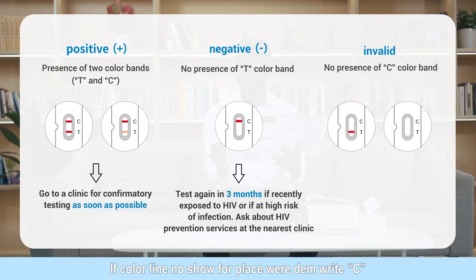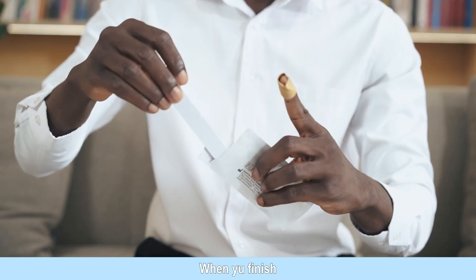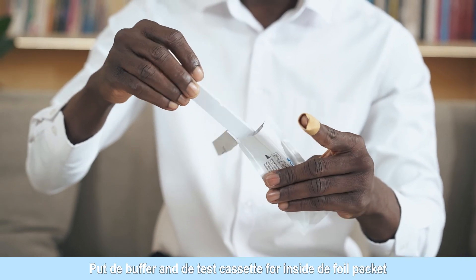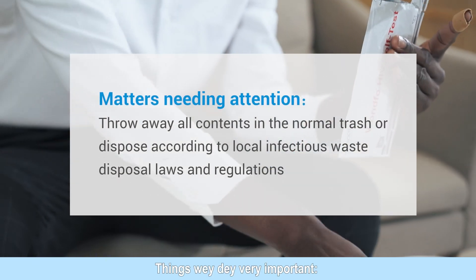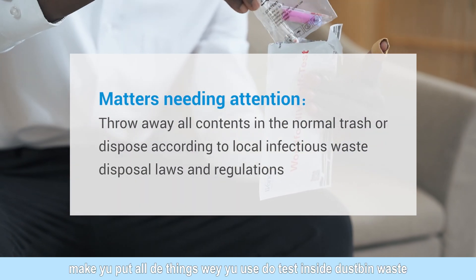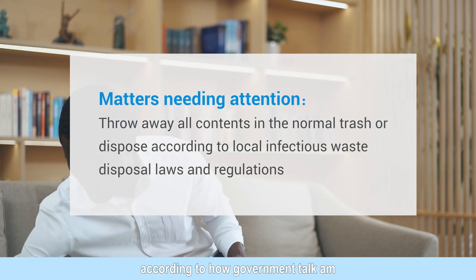No presence of C color band indicates invalid. Please run another test or go to a clinic for confirmatory testing. Put the buffer and test cassette into the foil pouch after testing. Throw away all contents in the normal trash or dispose according to local infectious waste disposal laws and regulations.